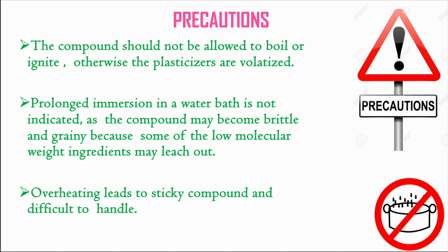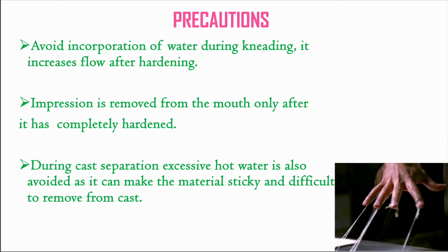The precautions that you need to follow while using impression compound, the first being the compound should not be allowed to boil or ignite, otherwise the plasticizers are volatilized. Prolonged immersion in a water bath is not indicated as the compound may become brittle and grainy because some of the low molecular weight ingredients may leach out. Overheating leads to sticky compound and it might become difficult to handle.